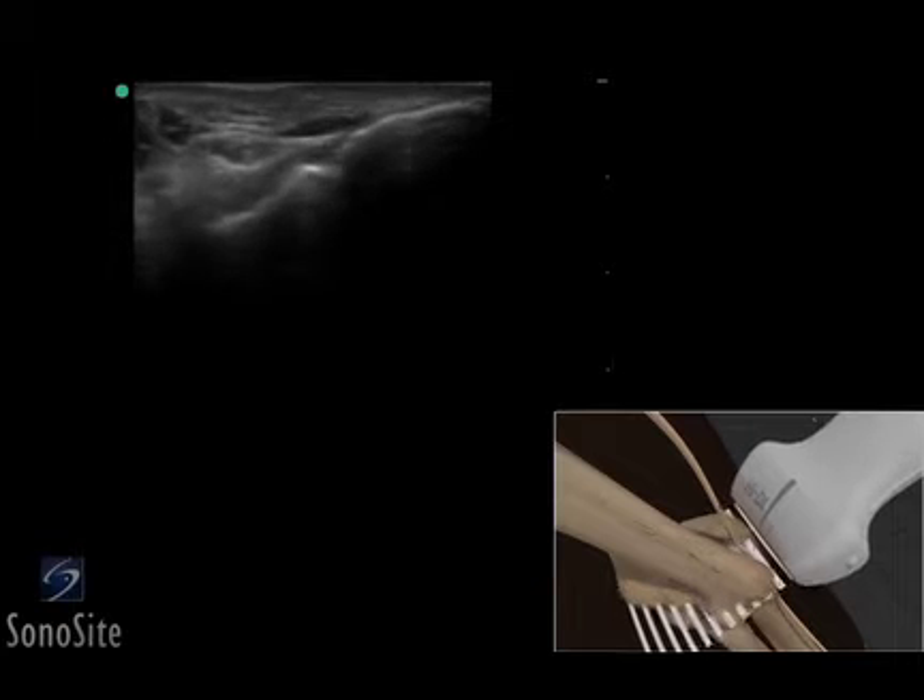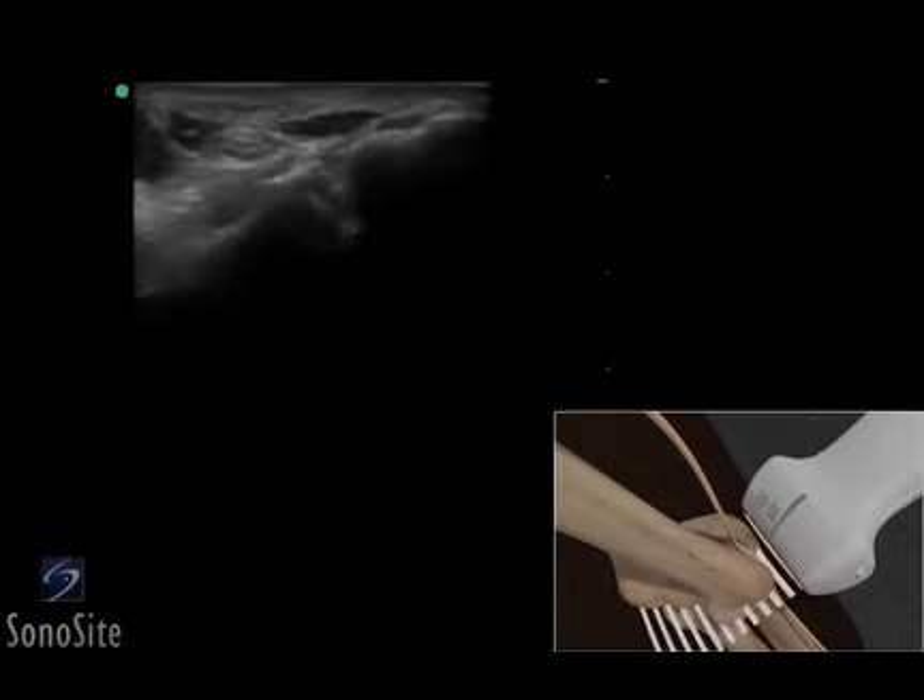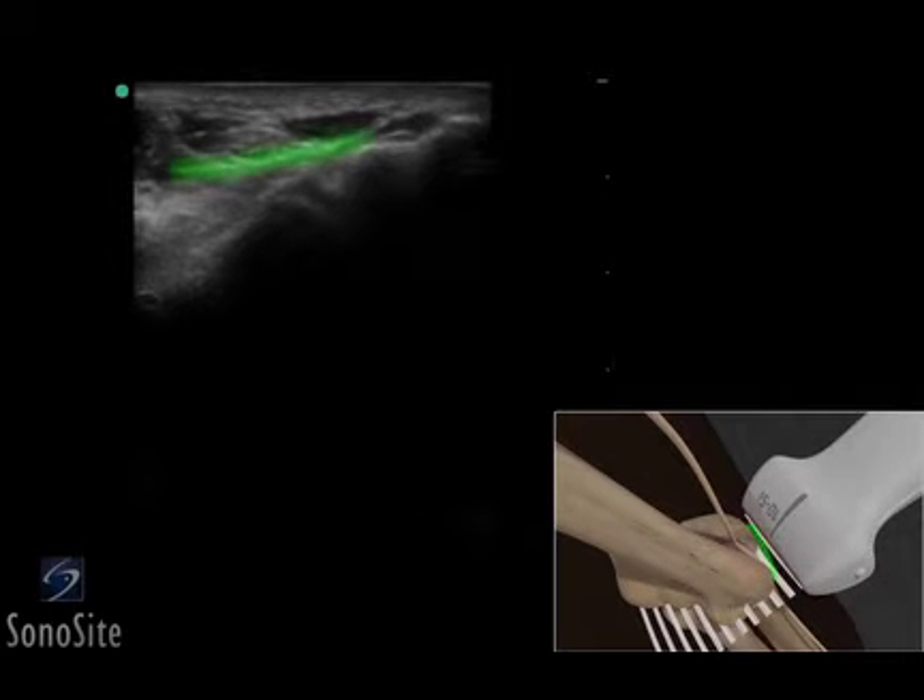The transducer should be slowly moved distally to evaluate the cubital tunnel. The cubital tunnel retinaculum appears as a hyperechoic line above the deeper structures.